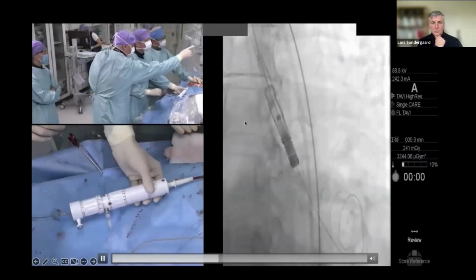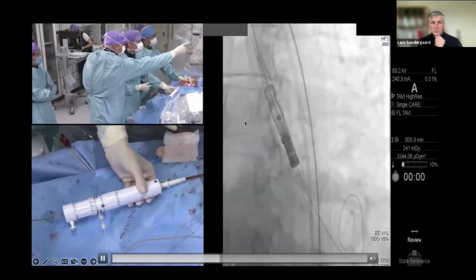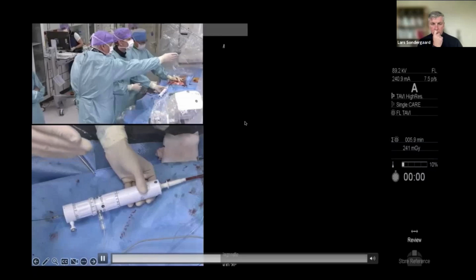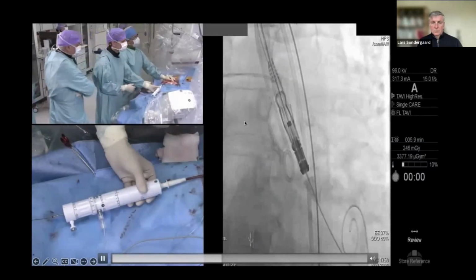So again, you see at the top of the screen those 3 posts. You want 1 on the right-hand side of the screen. 2 should be overlapping on the left-hand side of the screen. Below, you see the free stent strut sticking out, so that should be isolated here. So here you're almost pretty there. We're pretty close.